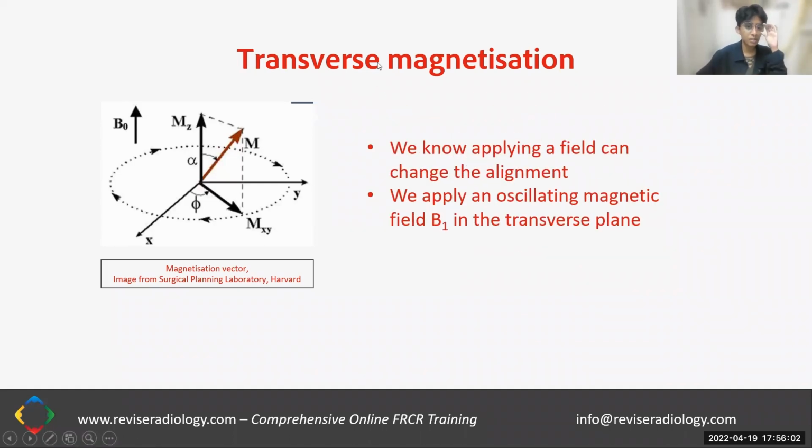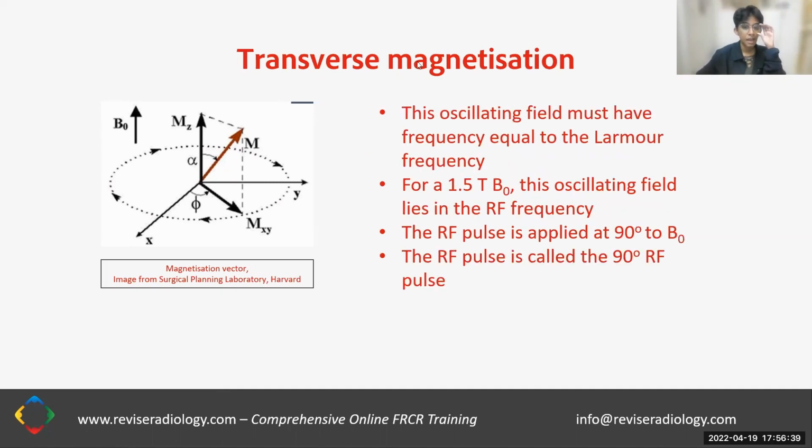So what happens is you have this magnet which is spinning in one direction. It's already being acted on by a field and it's precessing as well. You have to remember that precessing motion. Now when you apply a field in the perpendicular direction, that field is going to pull the magnet. If you remember that gyroscope in your mind, that line which passes through it is going to describe a spiral down, down, down, down, until it's fully spinning in the perpendicular plane. That's what we expect will happen.